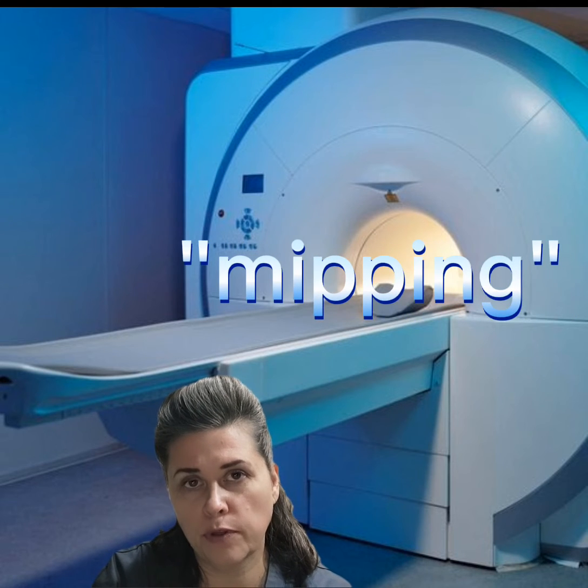After the scan is done, we have to do some more work to the image. We must do some post-production with the image. So for that, we have to use a tool, scissors, or scalpel and cut out all the blood vessels that don't belong to the circle of Willis.